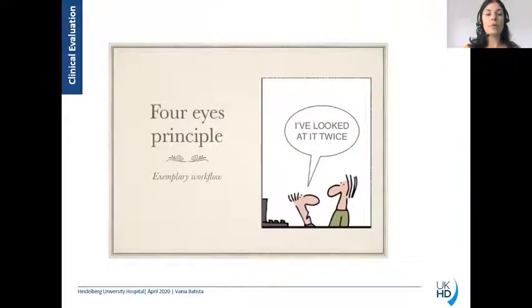So, looking at the clinical evaluations of this new module, the video postural module. The video is like a third or second RTT that you have in the room. It confirms and gives you a quick overview if you are placing the patient in the correct position, for example if you are placing the immobilization devices correctly. If something is wrong, you can easily have a look at the video function and confirm if you need to change something and how to change, for example, the arm position or the breast.